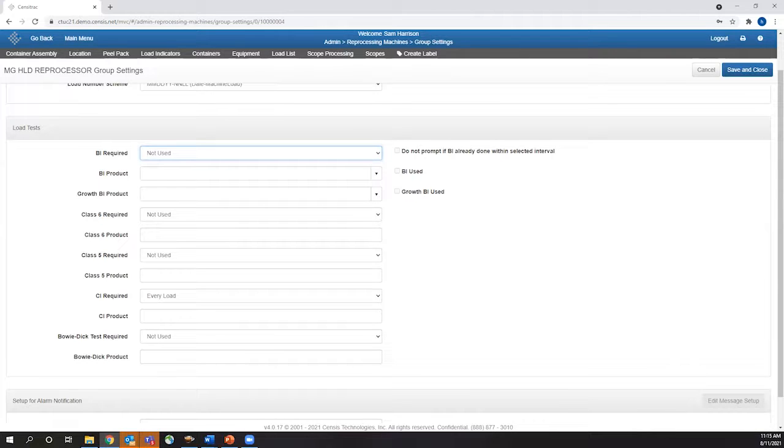Or if you pass off with somebody else, then they're documenting that information for you. So I recommend using it in processing steps, as Sam had mentioned. I've seen where customers have created an ATP or residue pass/fail barcode, one that says pass, one that says fail. If it fails, then you start the process over. If it passes, then you just scan it and continue on with your processing.